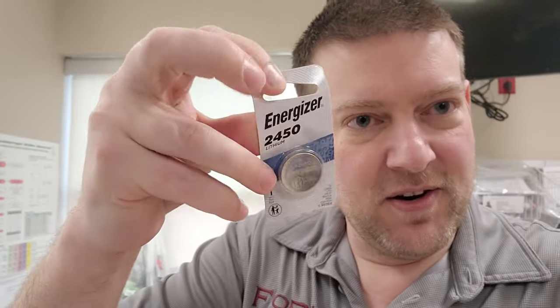I found another one. I'm over here fixing these infant radiant warmers, middle of Texas someplace, and I found another one with a dead battery. So guys, these things have two things that have to happen every 2 years. Internal 2450 coin cell, and you have to rebuild the blender. Blenders have to be done every 2 years.